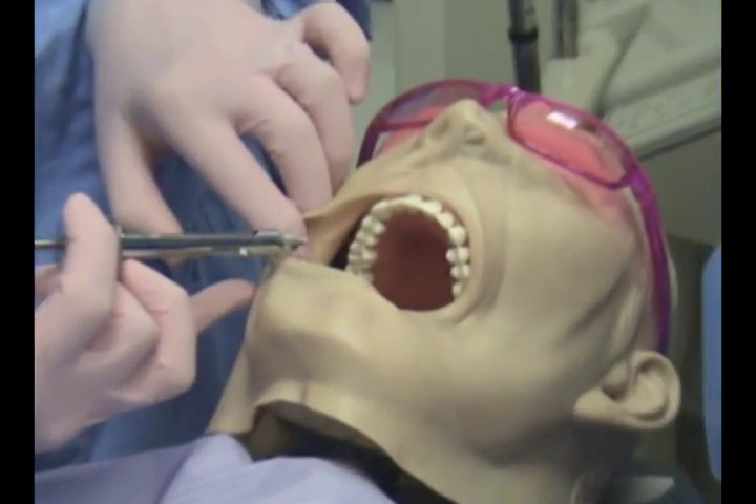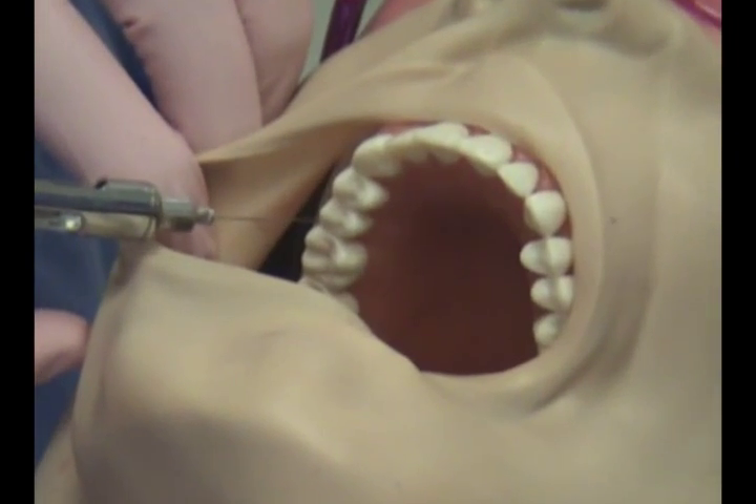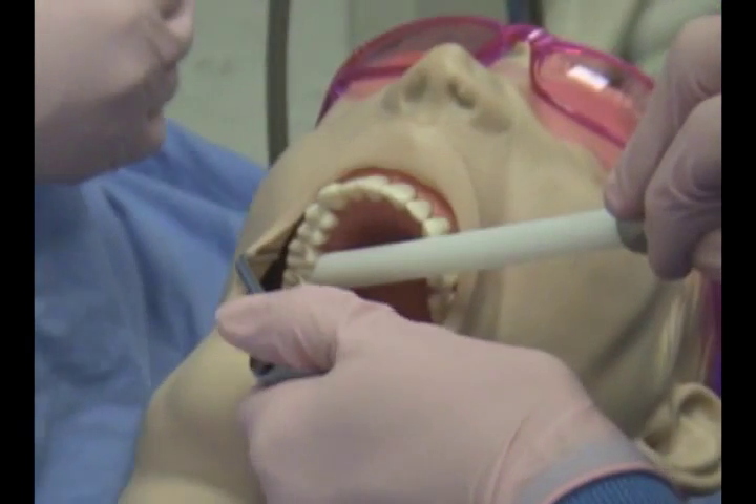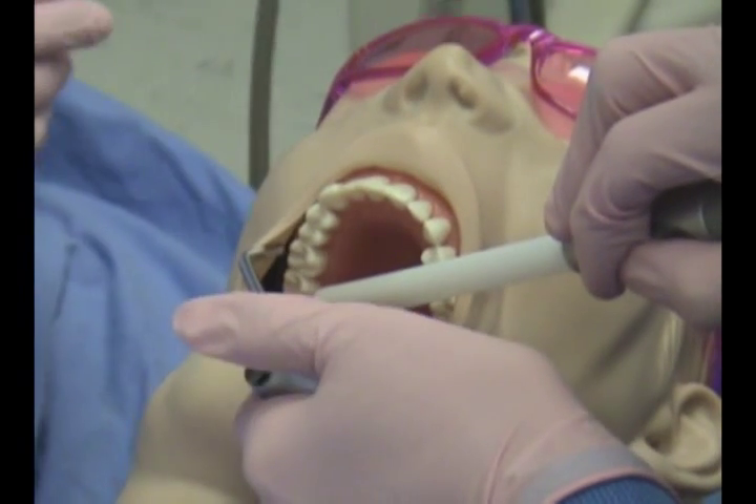Since we will be working on tooth number 3, the posterior and middle superior alveolar nerves will be anesthetized. A full mouth rinse is now performed to remove any taste of the anesthetic.